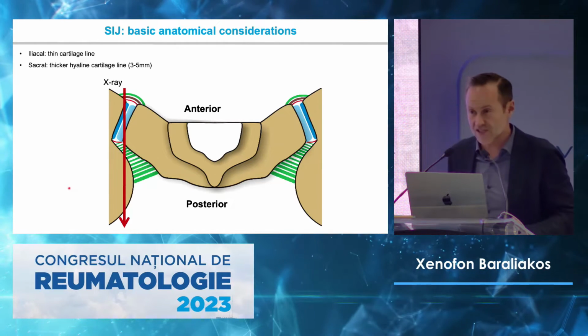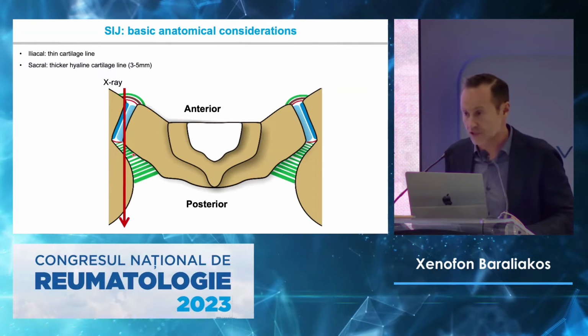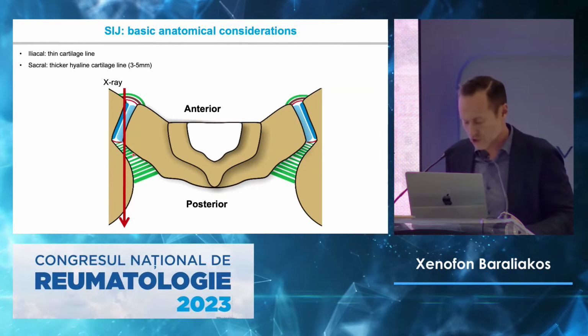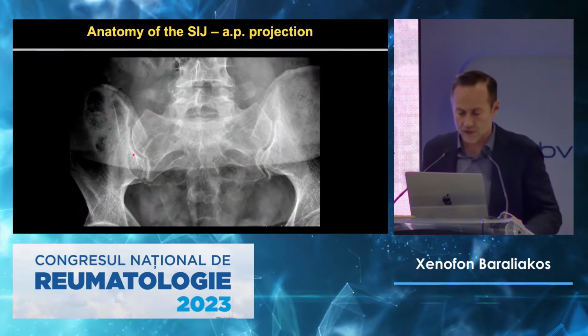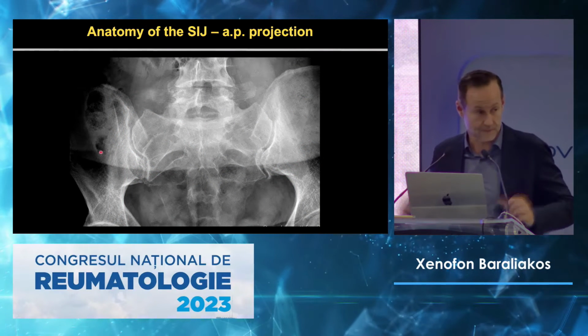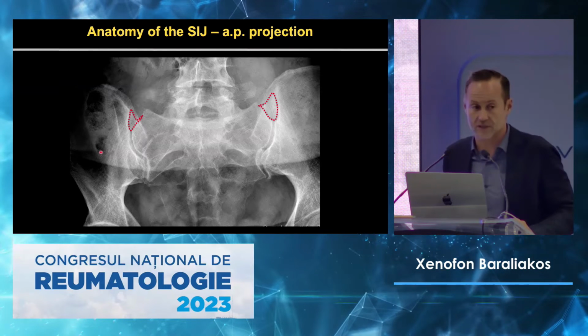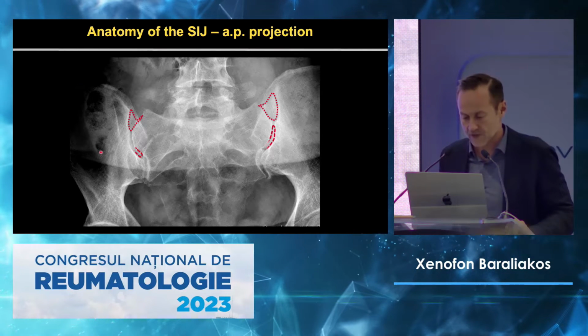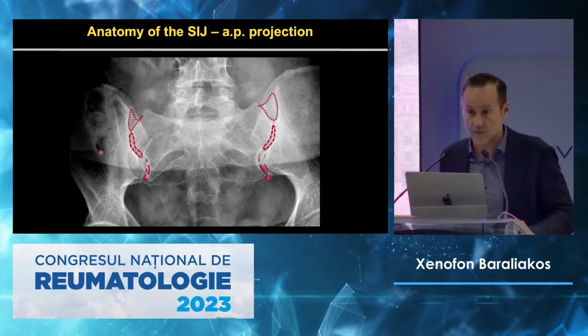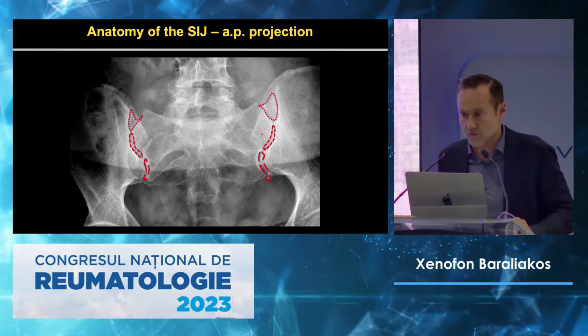That obviously is not good enough because you may have the cartilage, but you also may have the soft tissues, which brings us to the point that, especially when we do not have the right tilt in the sacroiliac joint, we also do not really see the three important parts, which is the upper, the mid, and the lower part. The most important of them is the middle part. This is where you have most cartilage.